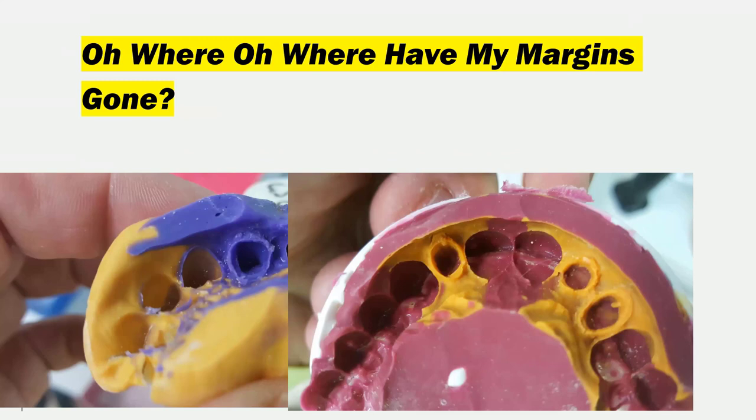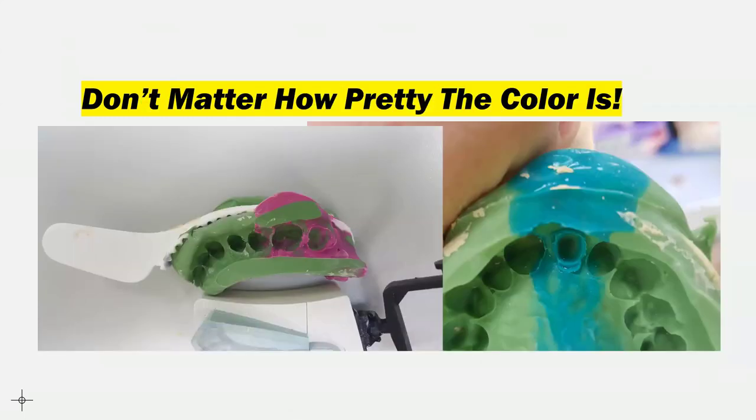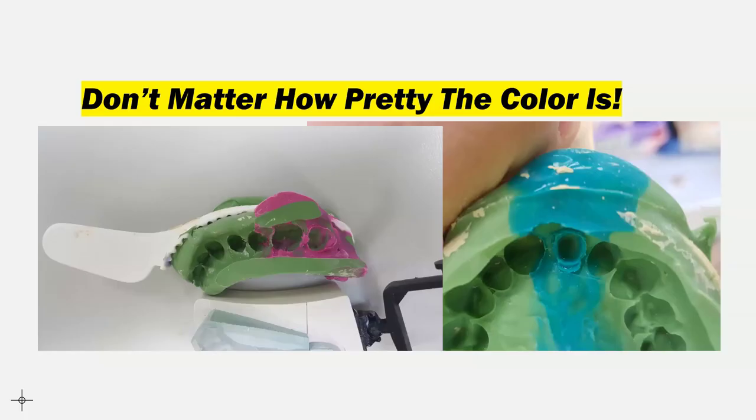I didn't believe that stat. So I went to my local dental lab and I said, Gary, I want to look at some impressions. And he said, okay, you can look at impressions. Don't look at the doctor's names. And I started seeing things like this. And this. But it should look like this. And this is what you should be able to get every time when using a diode laser, not missing margins like this.